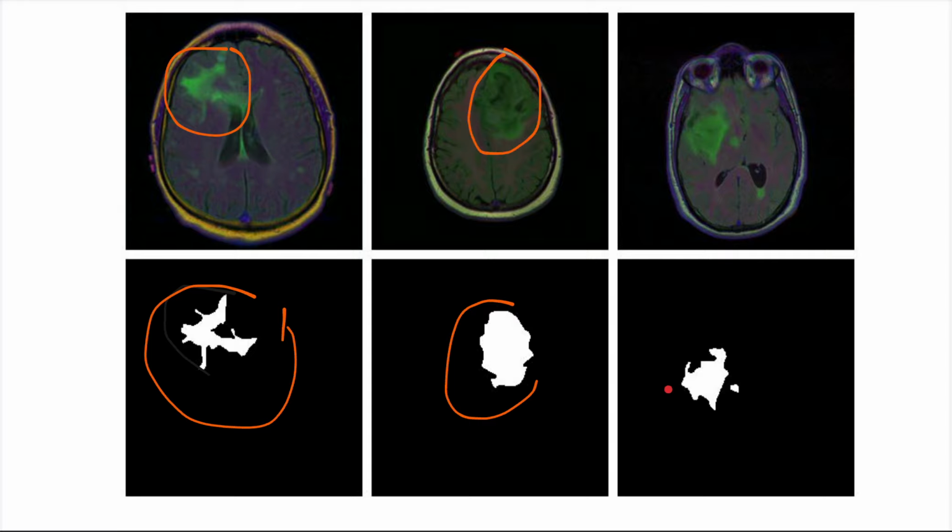Then this thing you see over here is also from here. All right, so what it does is look at the pixel intensity and compare it to the neighborhood, or the adjacent pixels, and try to pull that out. So what it's trying to do is to segment it from other pixels.